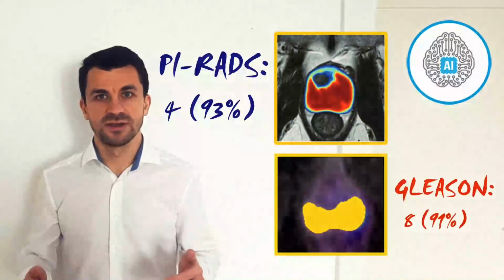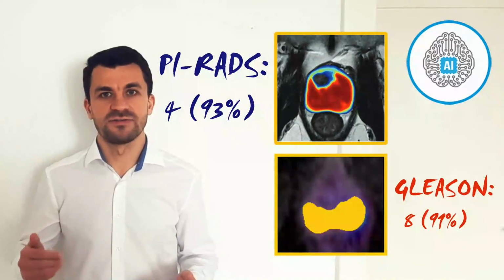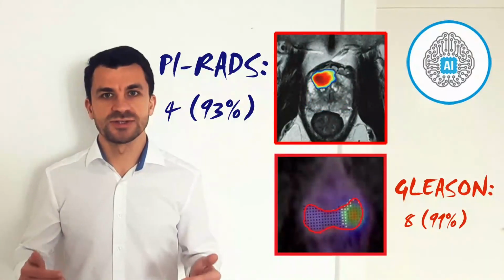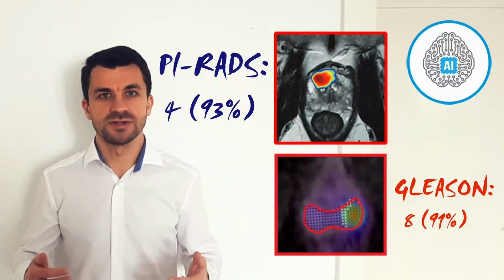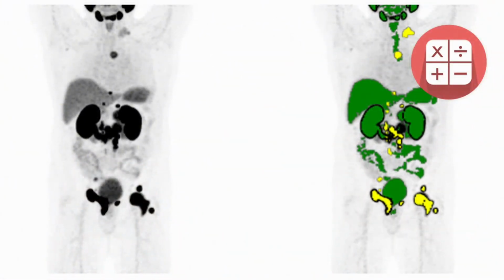Thirdly, machine learning-based techniques were trained to facilitate reporting and tumor grading by predicting the PI-RADS score from MR and the Gleason score from PET-MR images. Explainable AI models will produce attention maps showing the user the image features that inform the prediction. Finally, tumor metastases can be segmented from PET-CT images, allowing a rapid and automated estimation of total tumor burden.